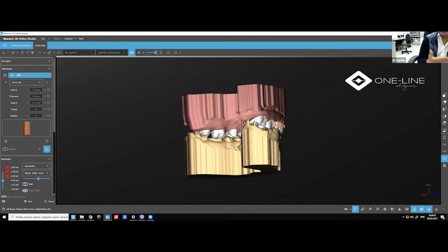We don't really practice it all the time, but you can do it like that. For most of the cases, you can have bilateral attachments to make sure that the teeth will actually move to the right place.